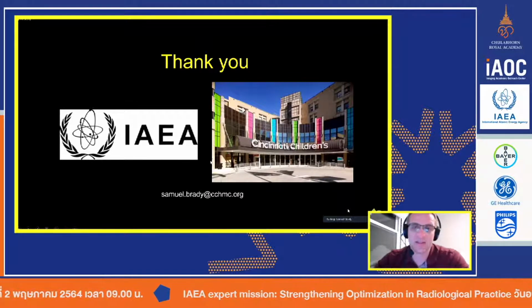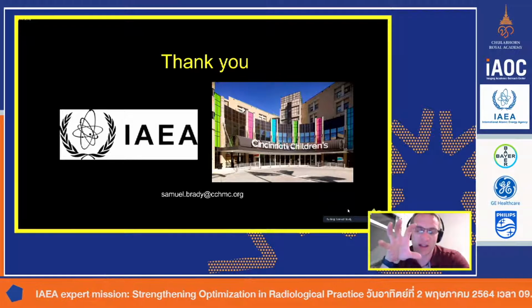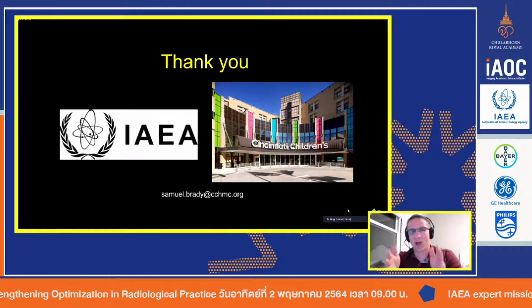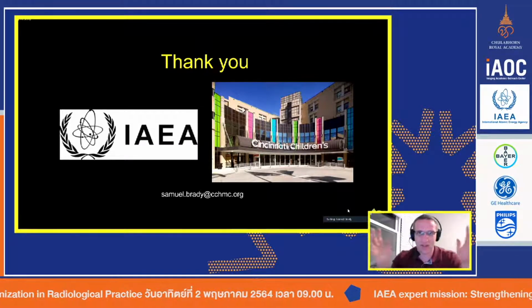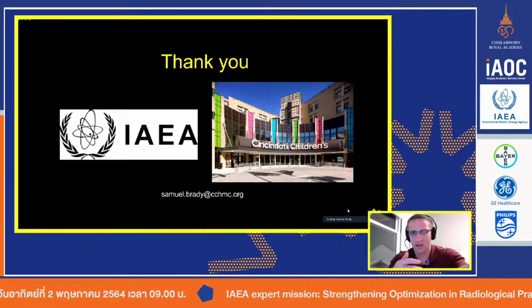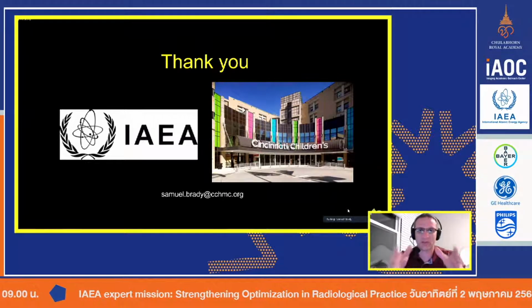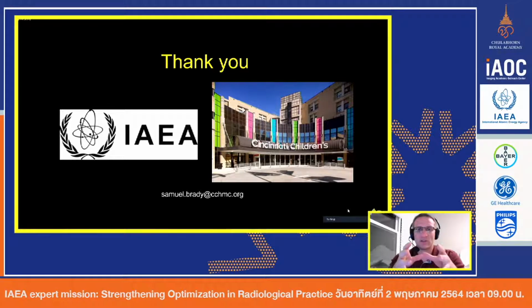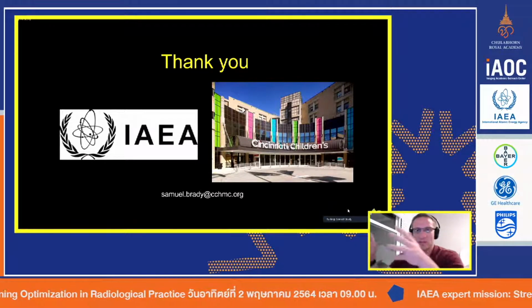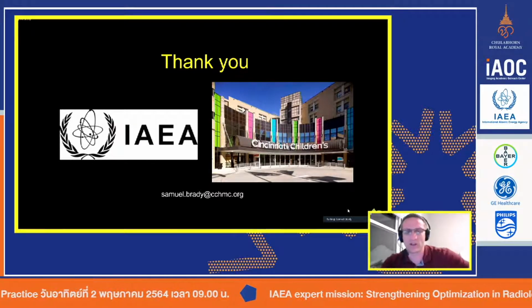So that is, in a nutshell, how to reconstruct your images. And as I tried to do, I stepped through every step of the reconstruction process, why it's important to get the patient centered, why you've got to get them collimated. You've got to already have done all the right things: get the right kV, the right mA, the right distance, you got the grid in. All of those steps are very important to get the right quality image. But then you have to push the right buttons on the reconstruction algorithm so that you get the right image to the radiologist. It's a big process to optimize all of your x-rays.